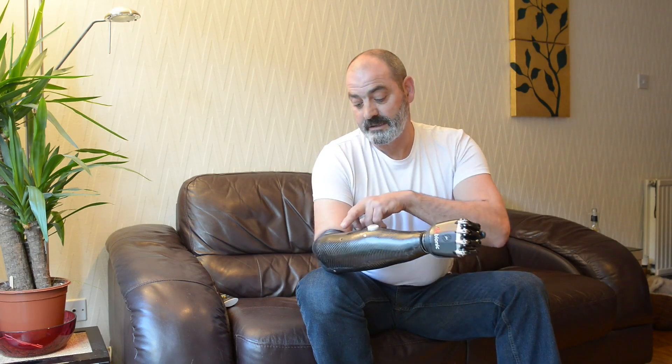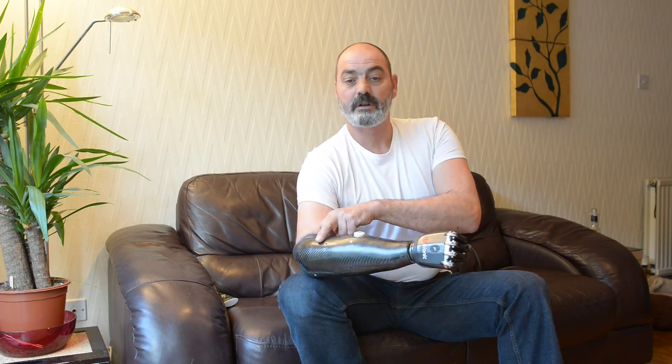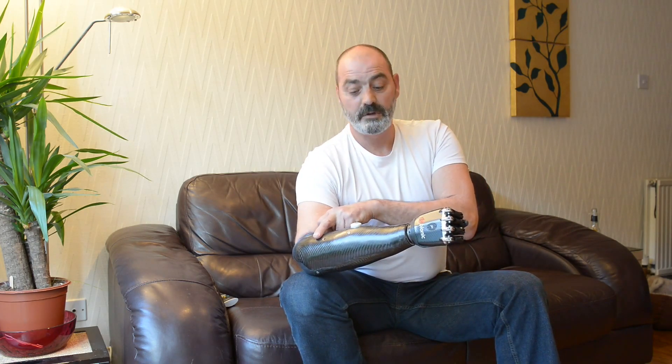This is the B-Bionic V3. It's a prosthetic hand and it works from sensors on the inside and outside of my arms and muscle control. If I activate this sensor, the hand opens. I'll activate this one, the hand closes.